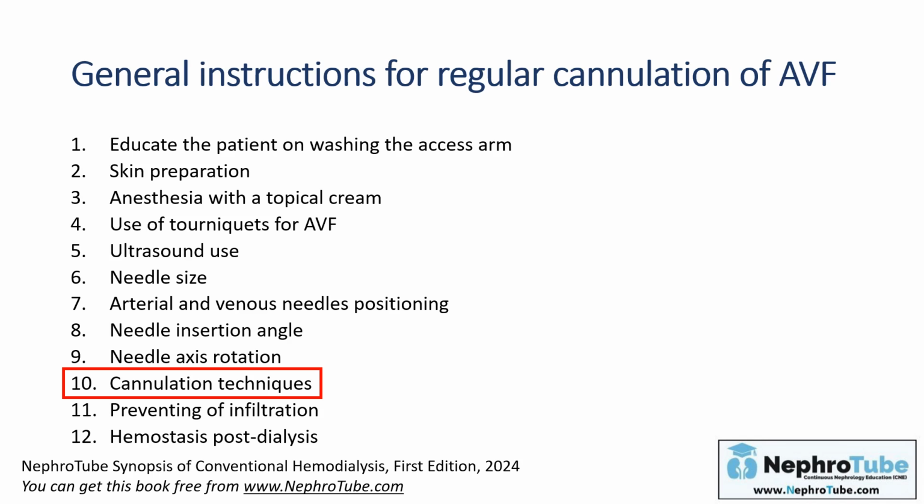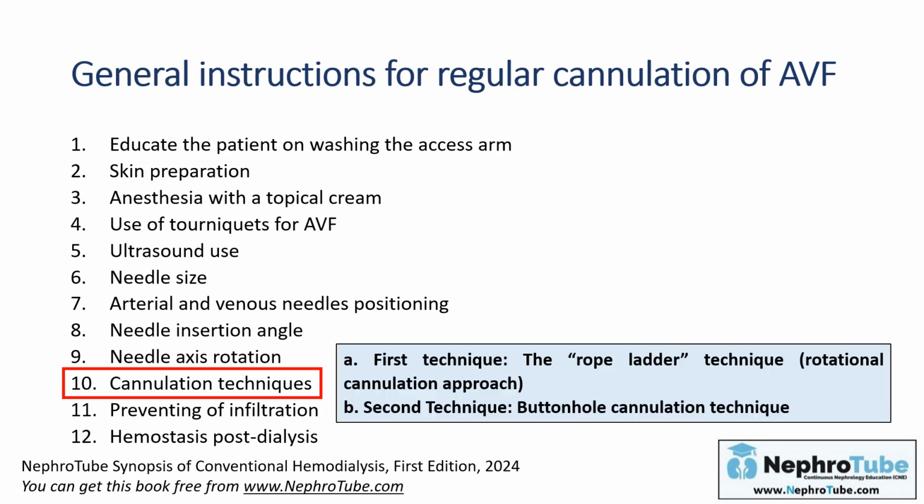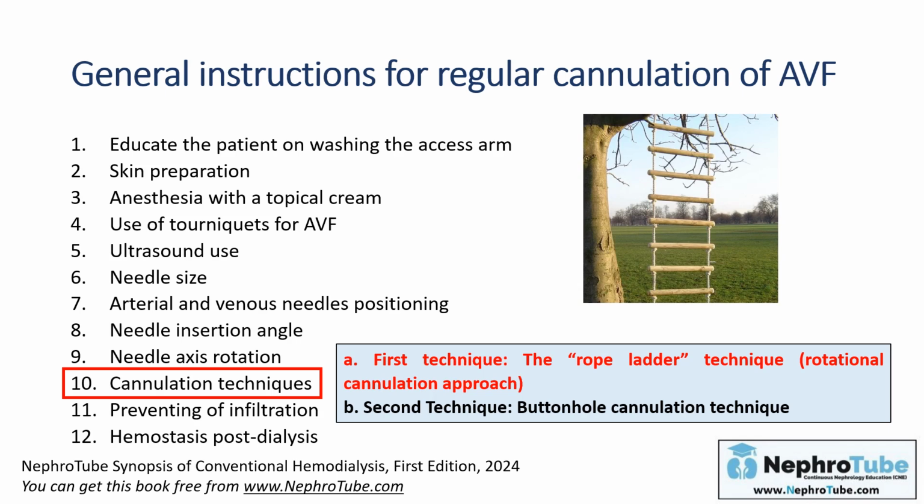Regarding cannulation techniques, and this is very, very important, we have two cannulation techniques. The first technique is the rope ladder technique. It's also called the rotational cannulation approach. And the second technique is called the buttonhole technique. I will start with the first technique, which is the rope ladder technique.